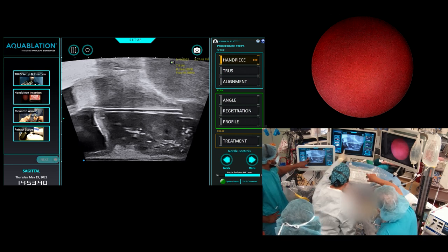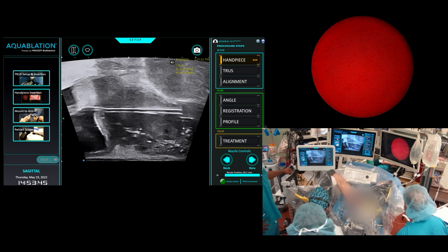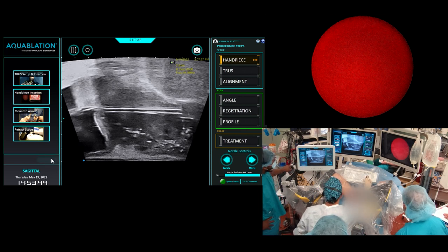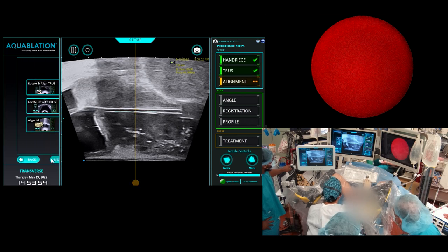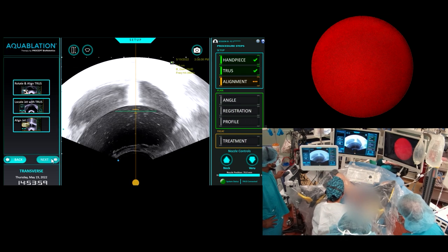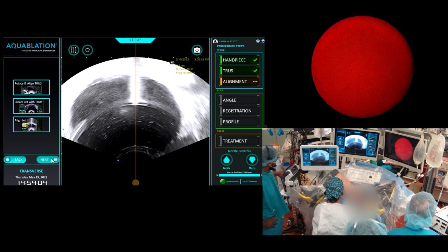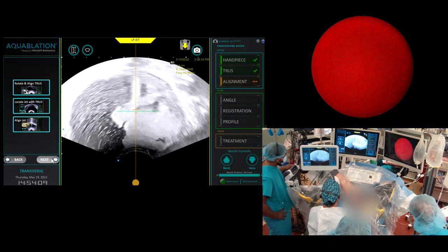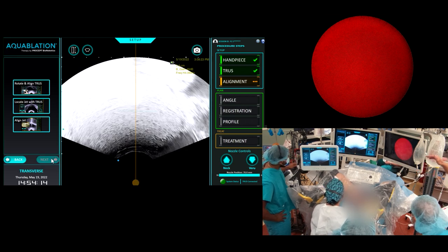I am in the bladder here. There's a channel that's in the bladder and the camera's in the — correct. The camera's on the tip, and the jet stream is at the tip with the camera on the side. So they're separate movements — it's a dual movement scope. Going a little bit with the scope; let's see once we clear up.